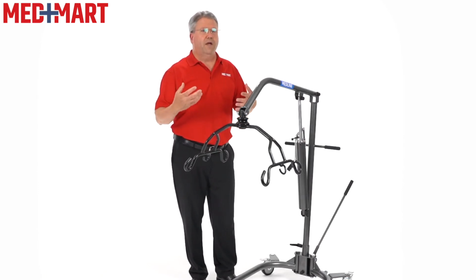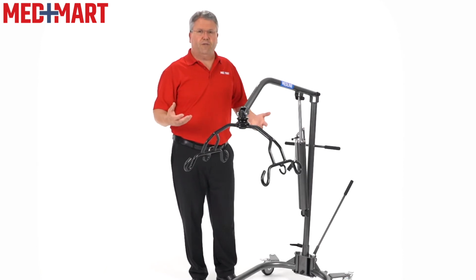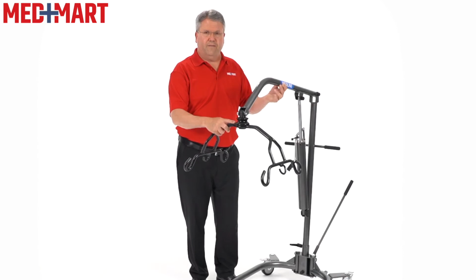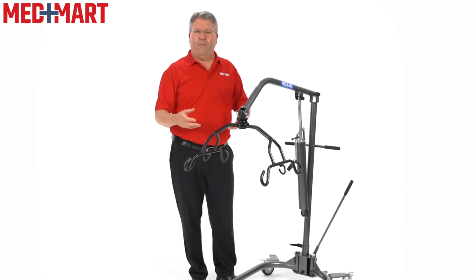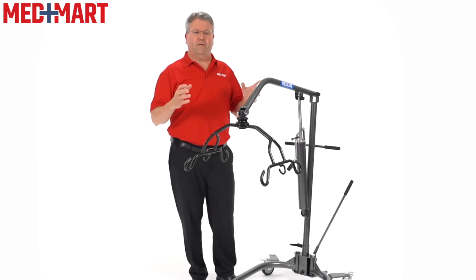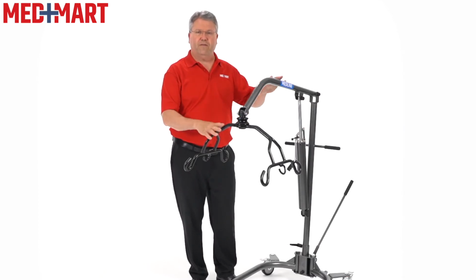So if you are, let's say 150 pounds, you're trying to move someone that's 200 pounds at approximately 80, 90 pounds for the weight of the lift itself, and you're going over carpet with thick padding, that's probably going to be difficult. So you have to keep that in mind and make sure you're considering the right lift for the right use.